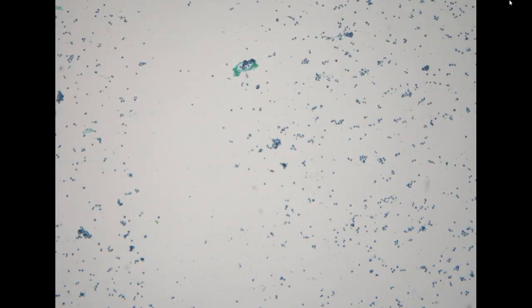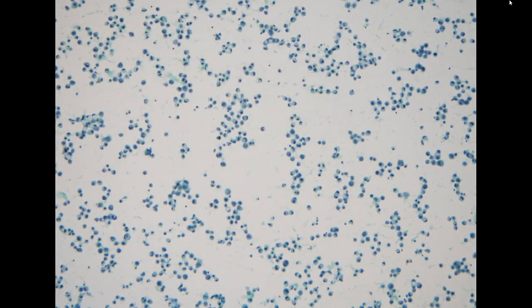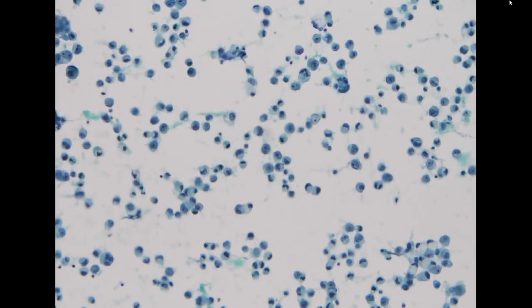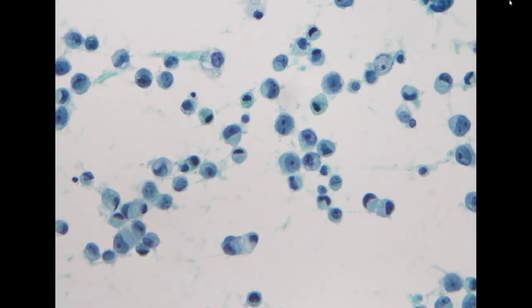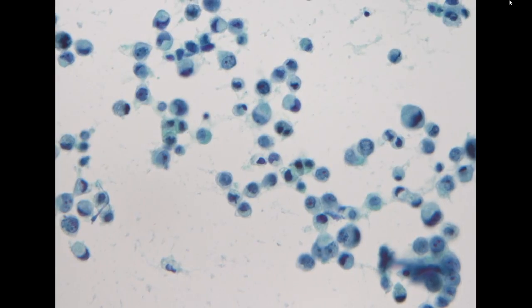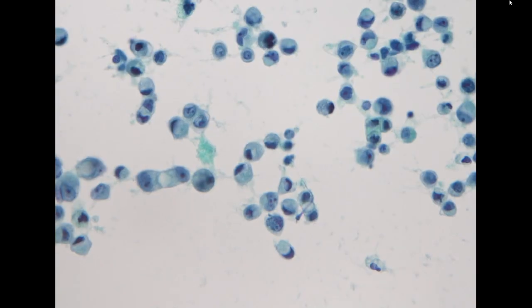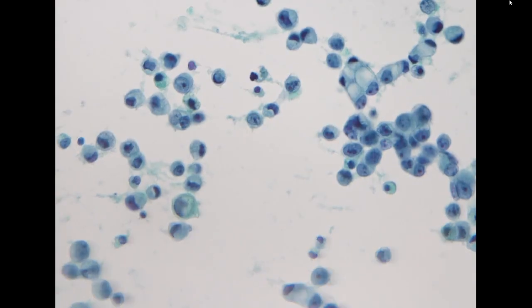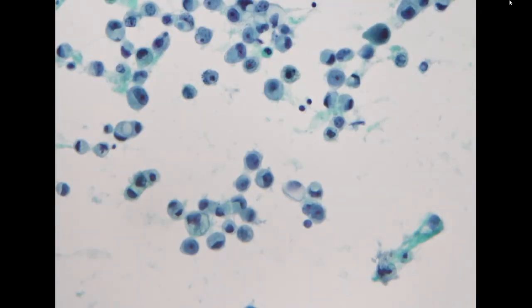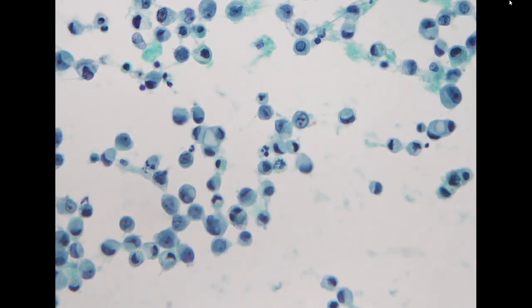So again, this is from the ascites. Very similar morphology, but very prominent signet ring cell features. So this patient actually had gastric cancer. It's a different patient. So this is compatible with gastric adenocarcinoma with signet ring cells. So this is much more typical for signet ring cell carcinoma coming from the stomach.